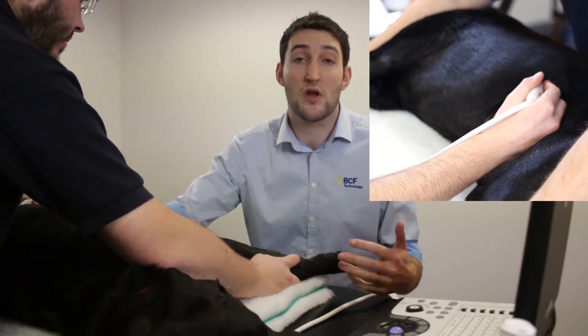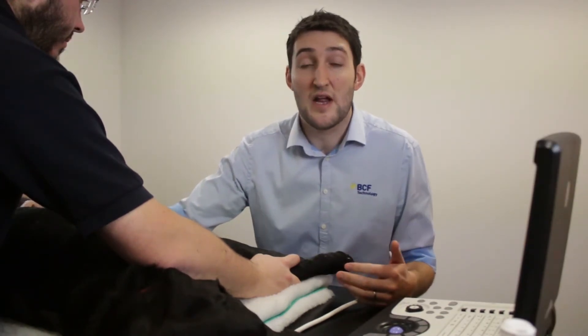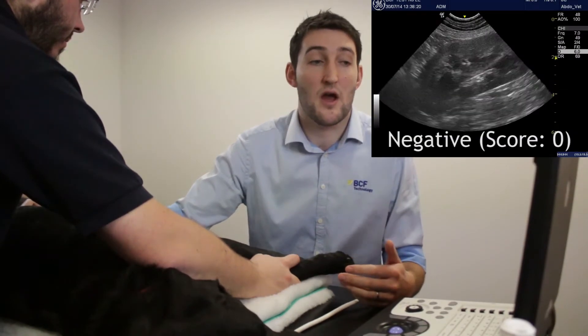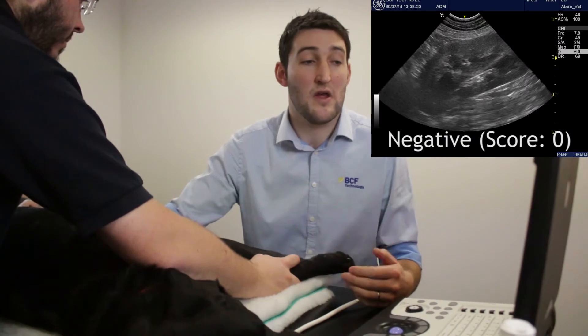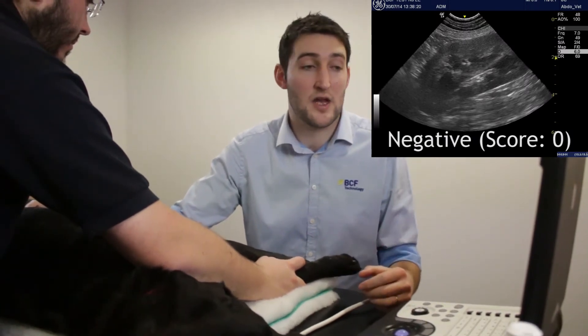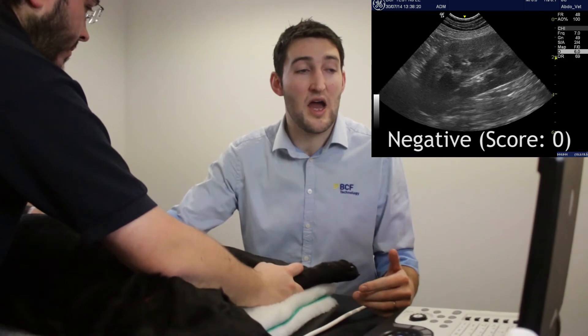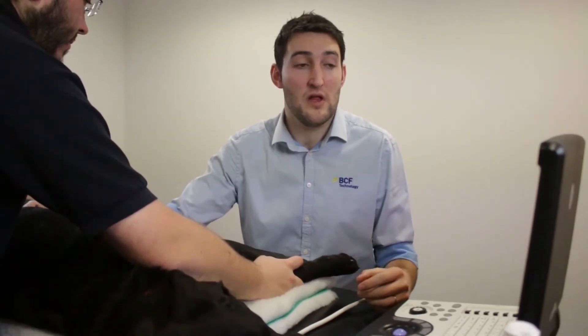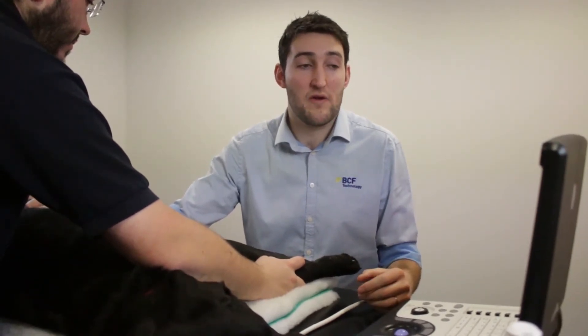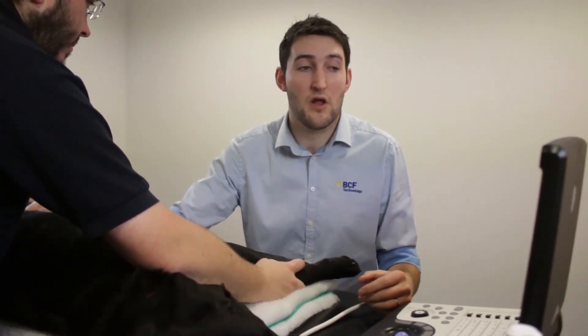Often we're just talking about quite a small amount of fluid in this site — a very thin anechoic black region and small triangles. Generally it's fairly obvious to see what we're looking for.